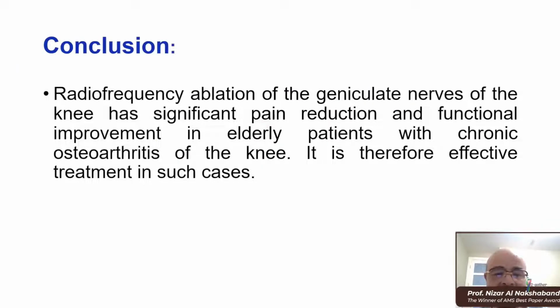So the conclusion is that radiofrequency ablation of the geniculate nerves of the knee has a significant pain reduction and functional improvement in elderly patients with chronic osteoarthritis of the knee. It is therefore an effective treatment of such cases, and it should be implemented by all interventional musculoskeletal radiologists and has a significant role instead of just corticosteroid injections.